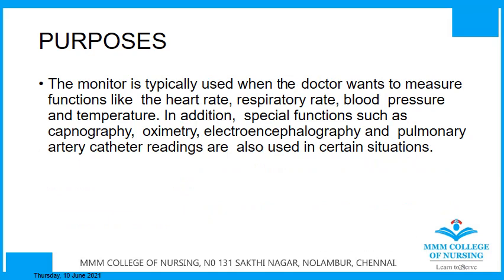Moving on to the purposes. It is typically used when the doctor wants to measure functions like the heart rate, respiratory rate, blood pressure and temperature. In addition, special functions such as capnography during intubation, oximetry, electroencephalography and PAC, that is pulmonary artery catheter readings, are also used in certain situations. So this is the ideal.